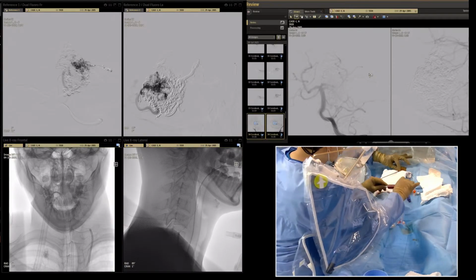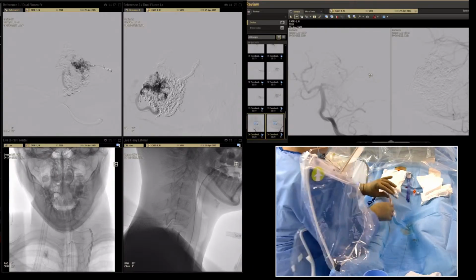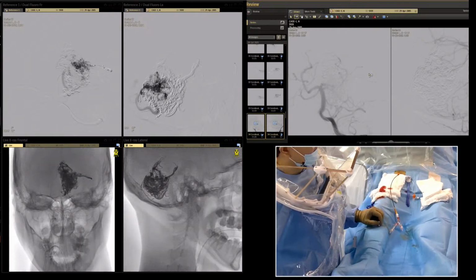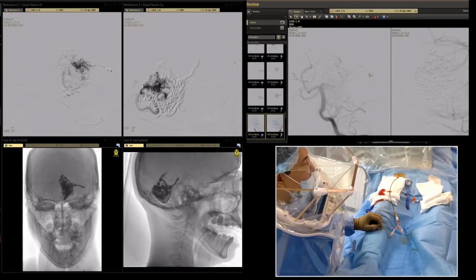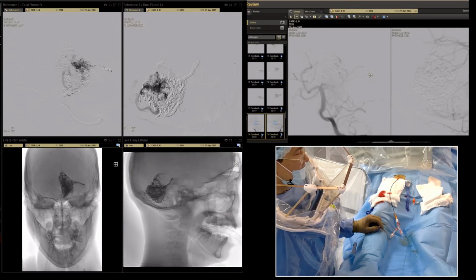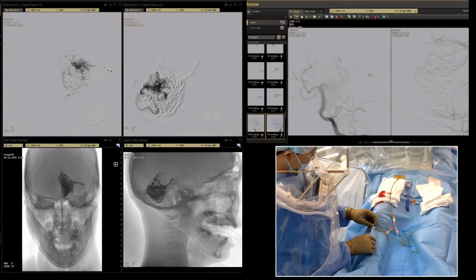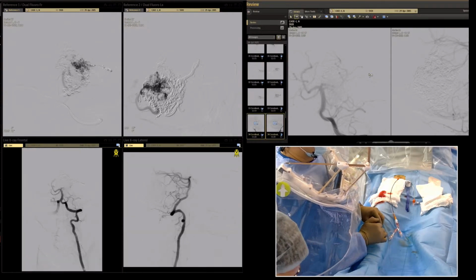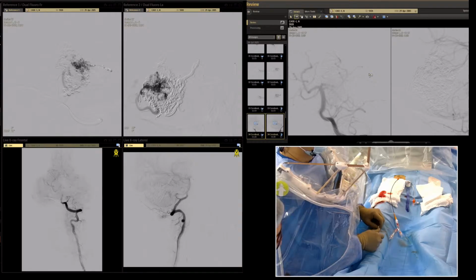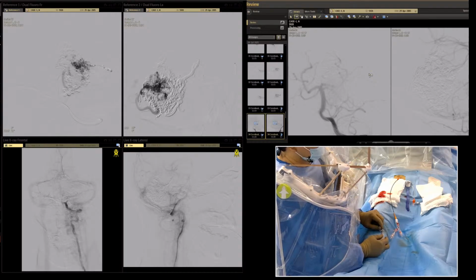Take them also. Also. It's prevention of possible complication. It's a regular thing to have some dots of microemboli in the territory. That's why we did it. That's okay.